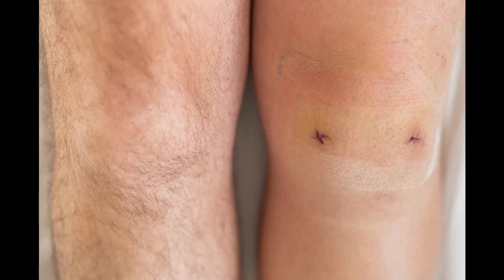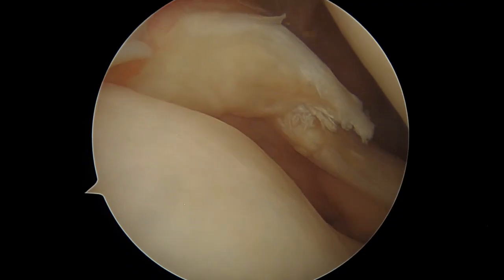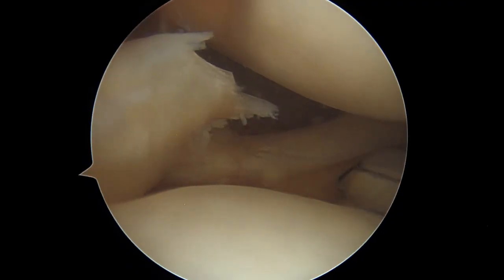So in this case, it's crucial to proceed with an inversion of the portals and to introduce our surgical tool, in this case the basket, through the anterolateral portal. This provides us a better angle on the torn meniscal piece and a more efficient action.